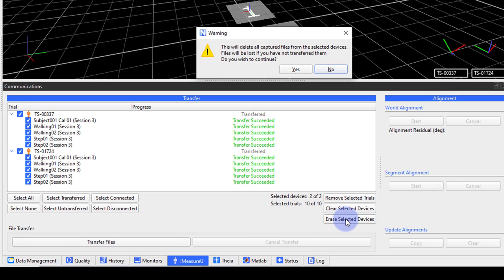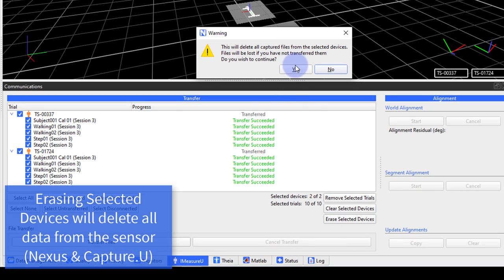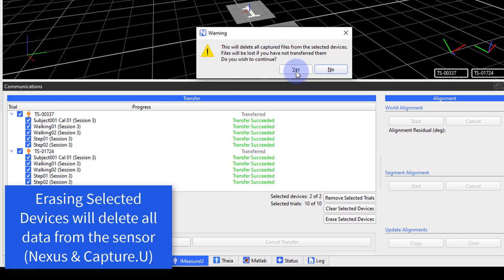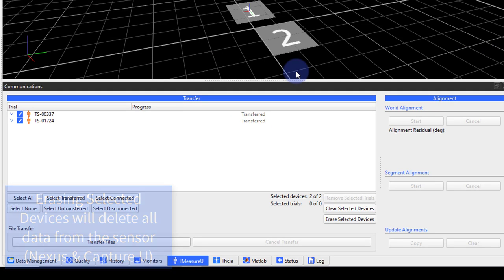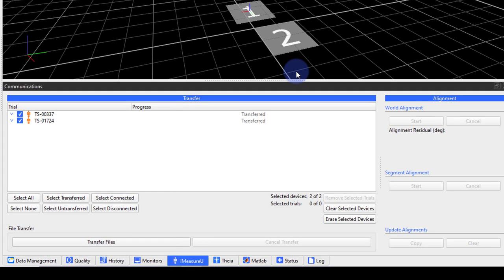Erasing devices will erase all the raw data from the sensors. Note that erasing devices will clear all data on the sensor, including data collected on other platforms such as CaptureU.